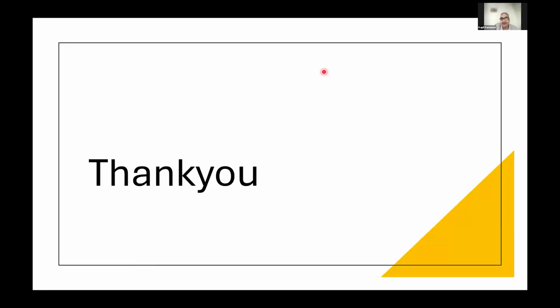Thank you. Since we are short of time, a few comments only. The first one: is there a way to identify antidromic tachycardia from ventricular tachycardia? Based on the ECG, if you can show VA dissociation, that's the most important factor in differentiating between antidromic tachycardia and VT. Other than that, we can't clearly differentiate between the two based on the ECG.